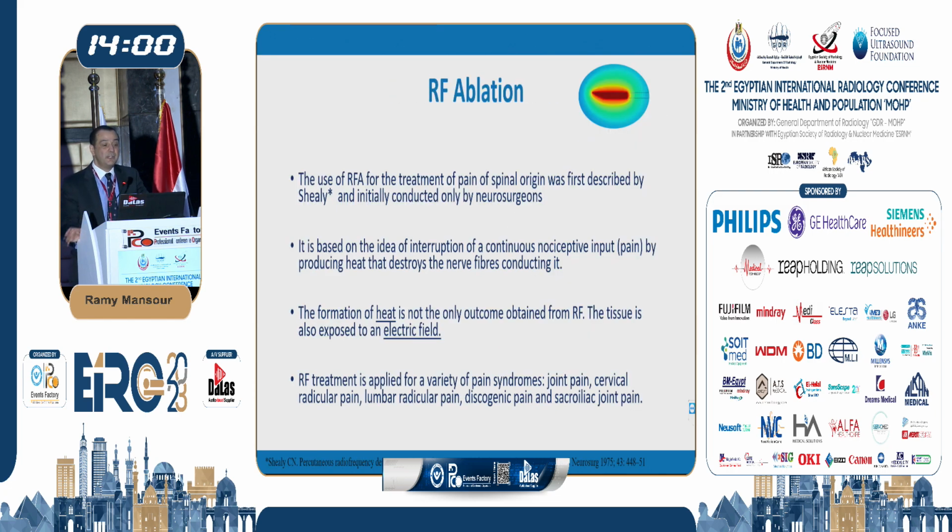Okay, so radiofrequency ablation is not a new technique. It's been there for more than 25 years. Ironically, it was done by the neurosurgeon. So this is probably one of the few things that we got from the physician. Most of the time it's the other way around. The physician and surgeon take from our techniques.